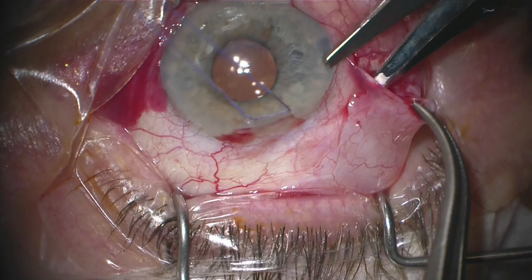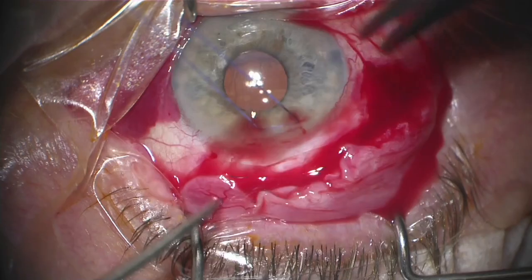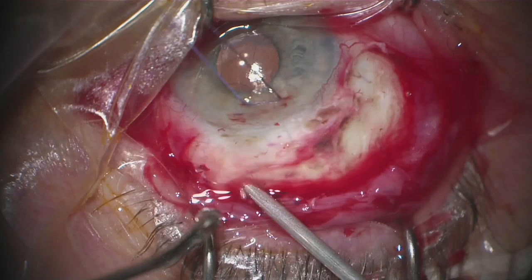We always start with the placement of a 6-0 vicryl traction stitch that allows for enhanced exposure. I like to open up in the horizontal meridian and continue my dissection up past the 12 o'clock area, maybe going an additional clock hour before making a second relaxing incision. The supra-temporal quadrant is my preferred quadrant of choice for implantation, and if this is not suitable, I will move to the infranasal quadrant.